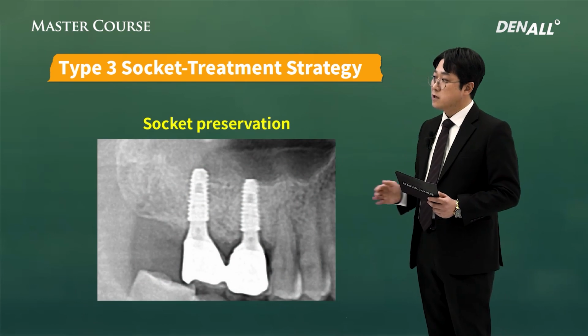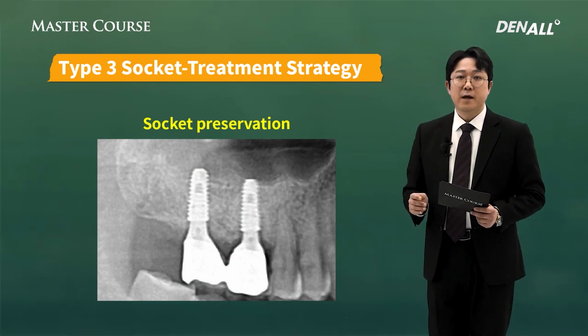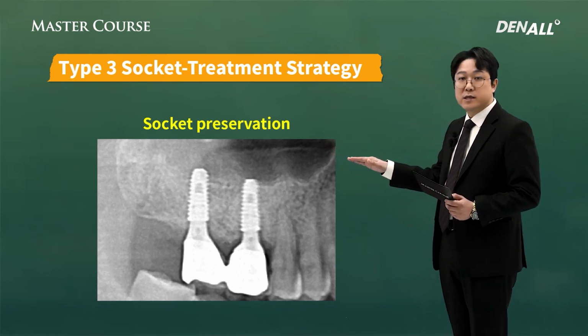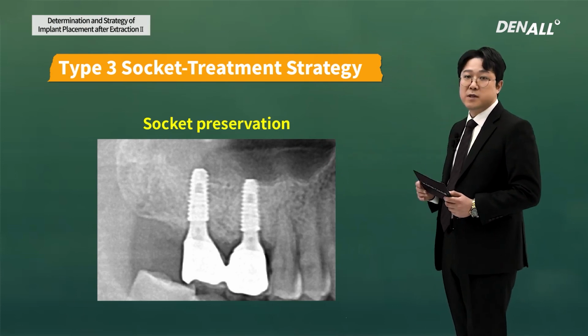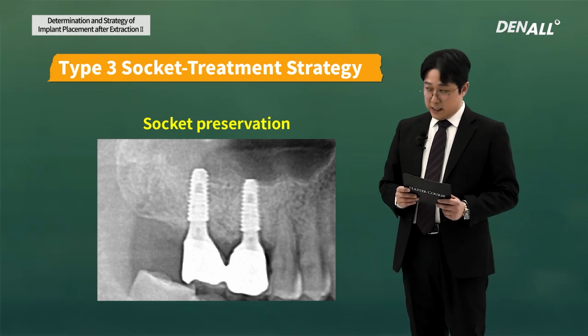After implant treatment, 6 months later, this is the panoramic image at follow-up. Socket preservation was done nicely, and the balance with the adjacent tissue is very nice, and it will lead to good long-term prognosis.